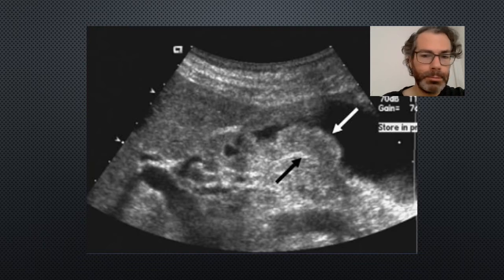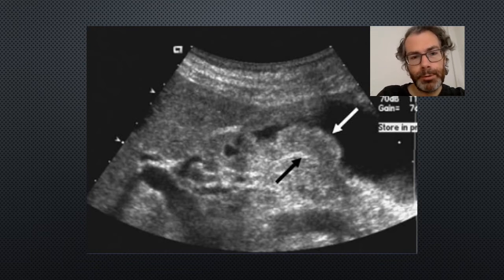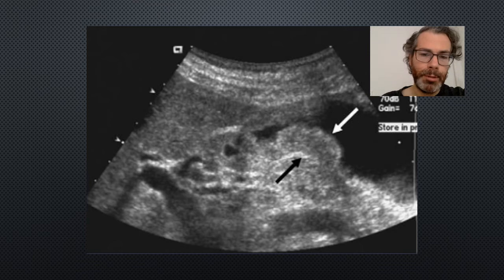So depending on the time of day, if it's during normal hours, you could potentially try and get a radiologist or a suitable expert to review this at the time. If not, get it reviewed at the earliest opportunity and arrange whatever further imaging or follow-up is needed yourself. So whether they need contrast ultrasound or a CT or an MRI, whether they need follow-up in a two-week wait clinic, make sure you arrange whatever follow-up is necessary.